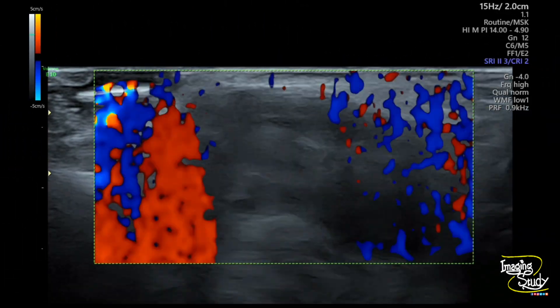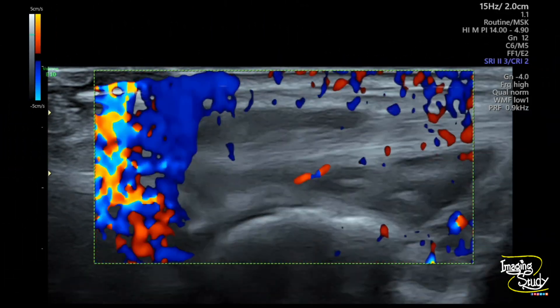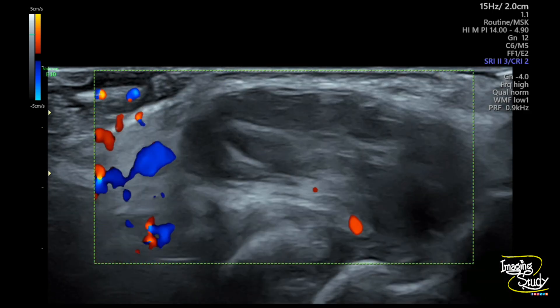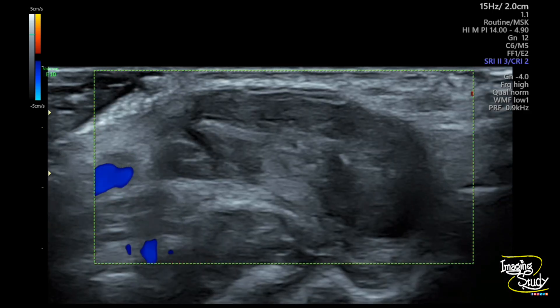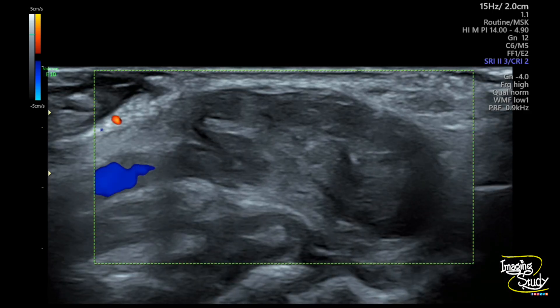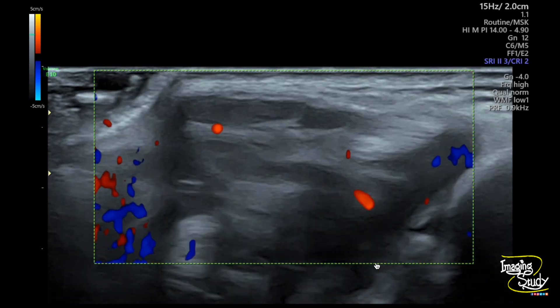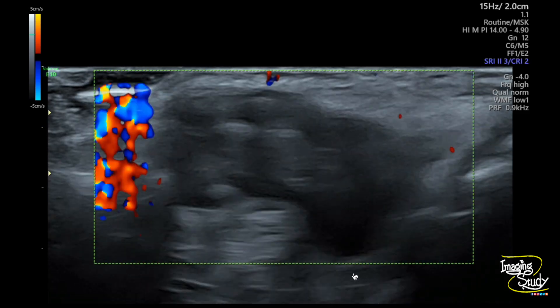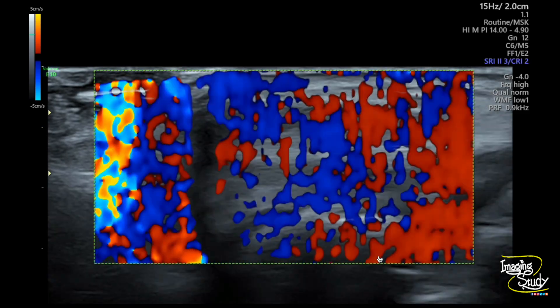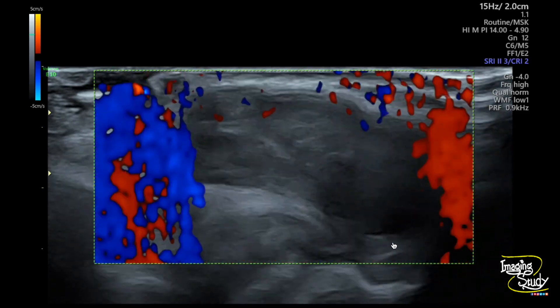Here is another view with the color Doppler. There is no internal vascularity. Only the regular peripheral wrist vessels are seen. Here is the communication stalk with the joint.